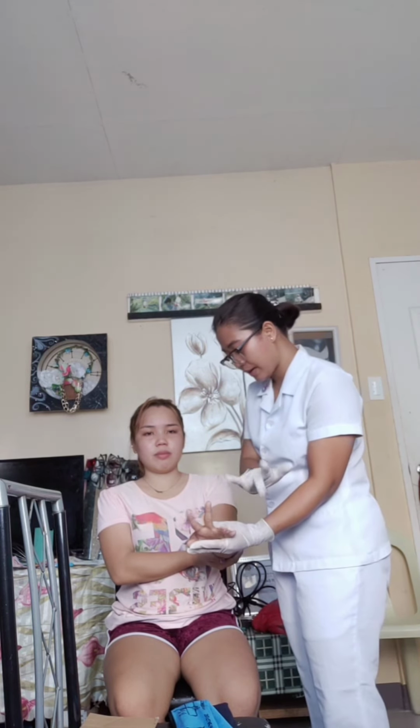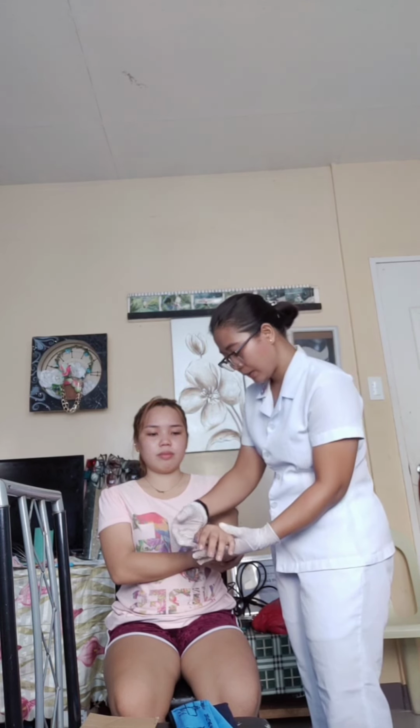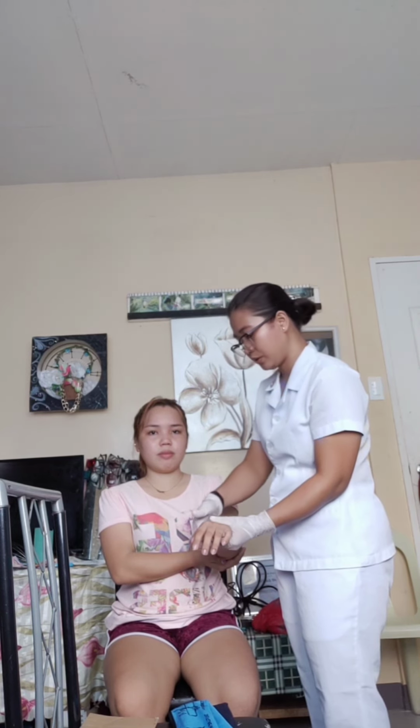Next is to check for the circulation: the feeling, the warmth, the color, and the pulse of our patient. Ma'am, pwede ni mo lihok ko ni mong fingers, ma'am? Okay. So, nails are pinkish. Check na ko imong pulse, ma'am, ha? And a good pulse. The patient can feel her arm and move her fingers, which is also in a warm temperature, has a good color with a good pulse, which signifies unimpeded circulation.